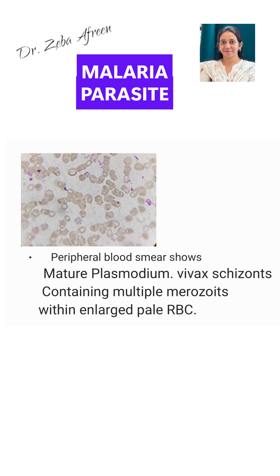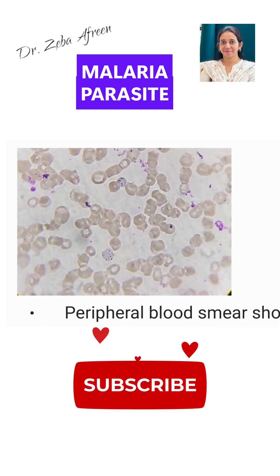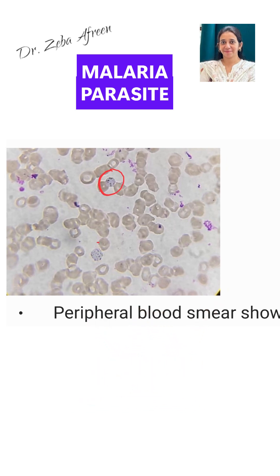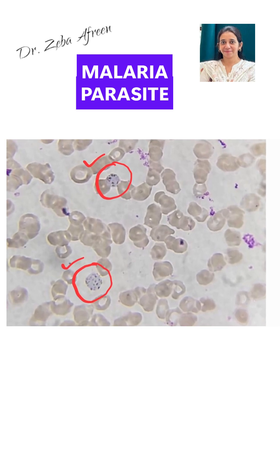This is a peripheral blood smear showing two mature Plasmodium vivax schizont forms. Look at these RBCs which I have encircled — they have multiple blue to purple chromatin dots. These are the merozoites.